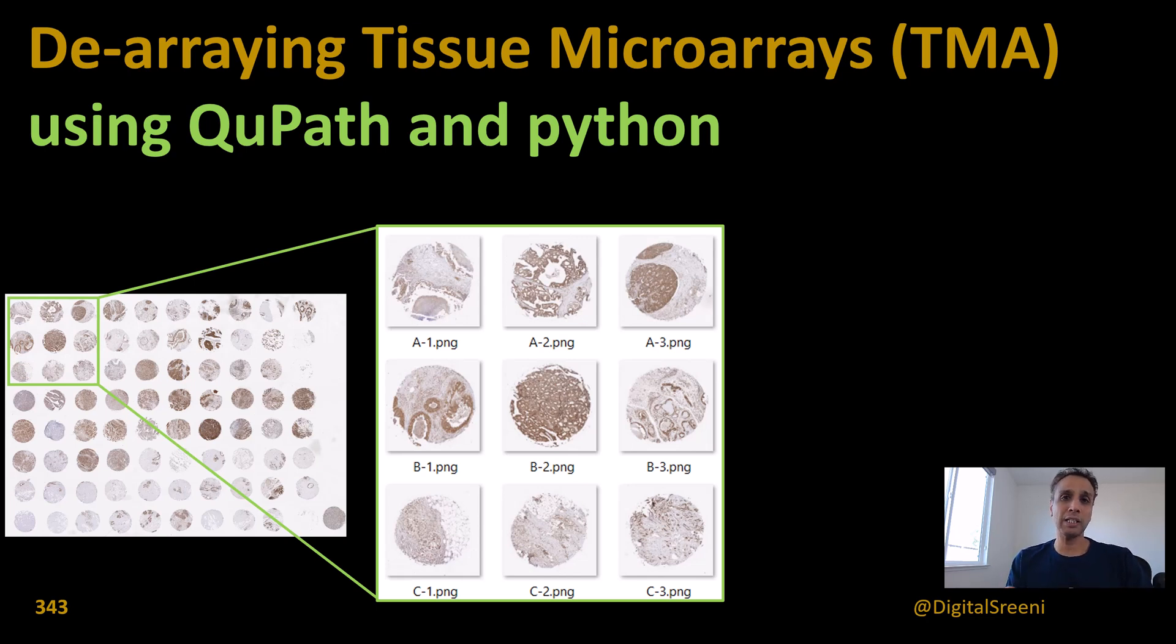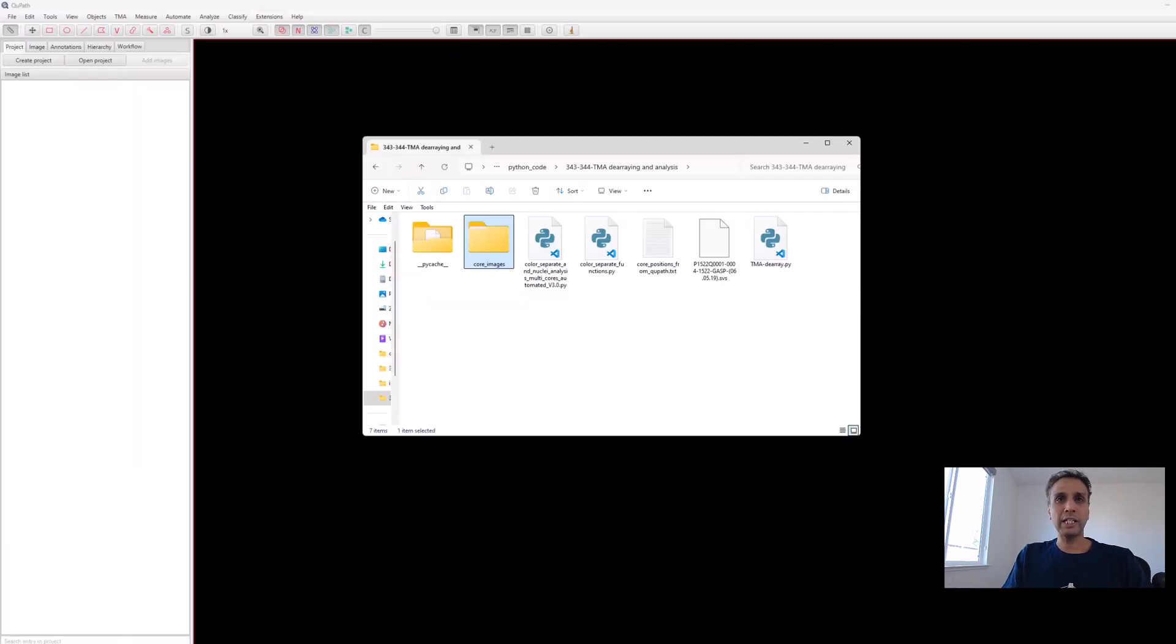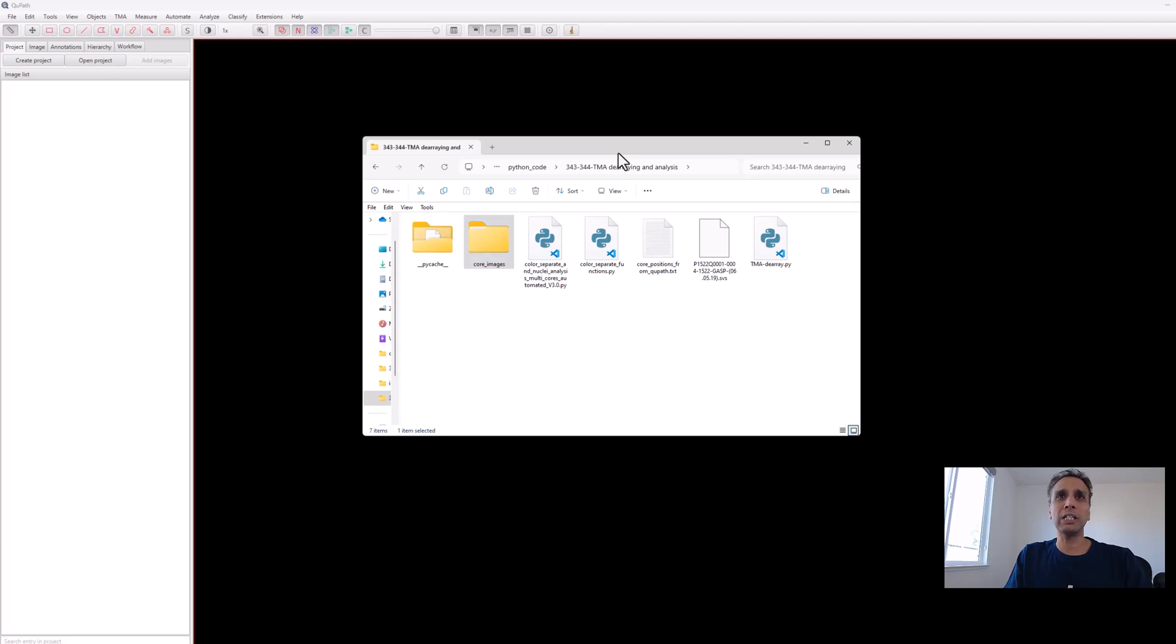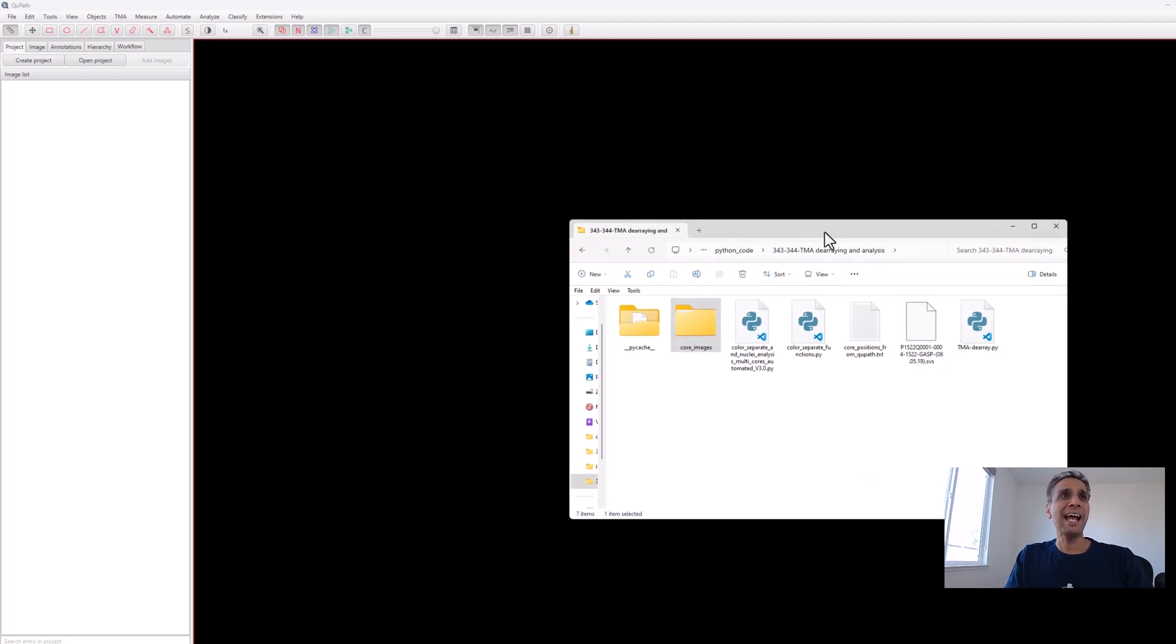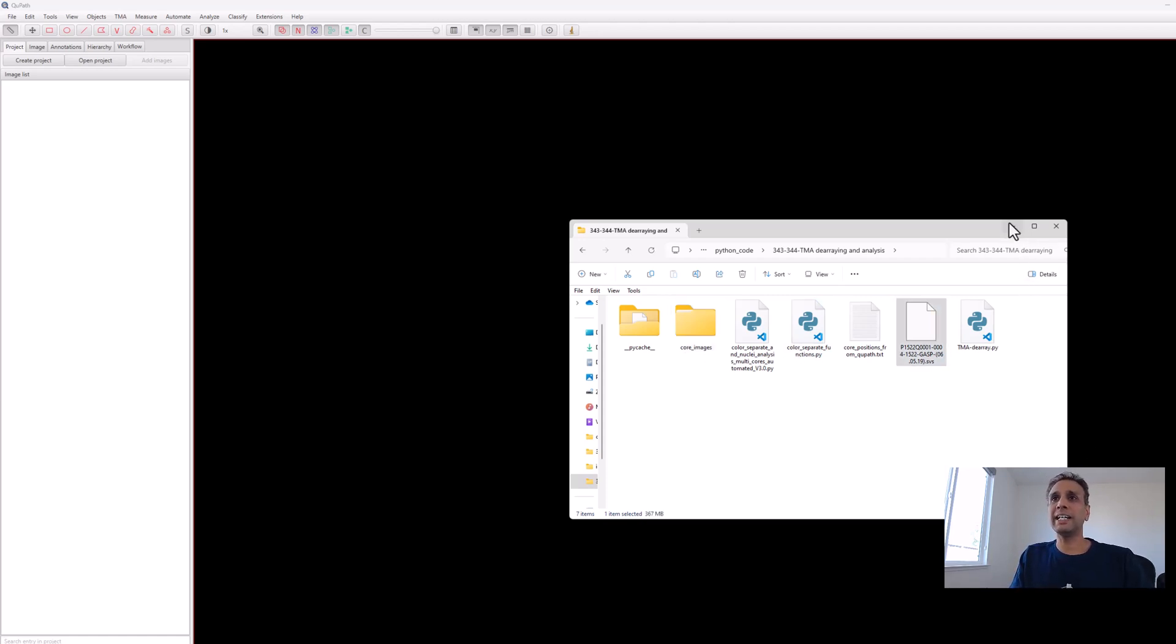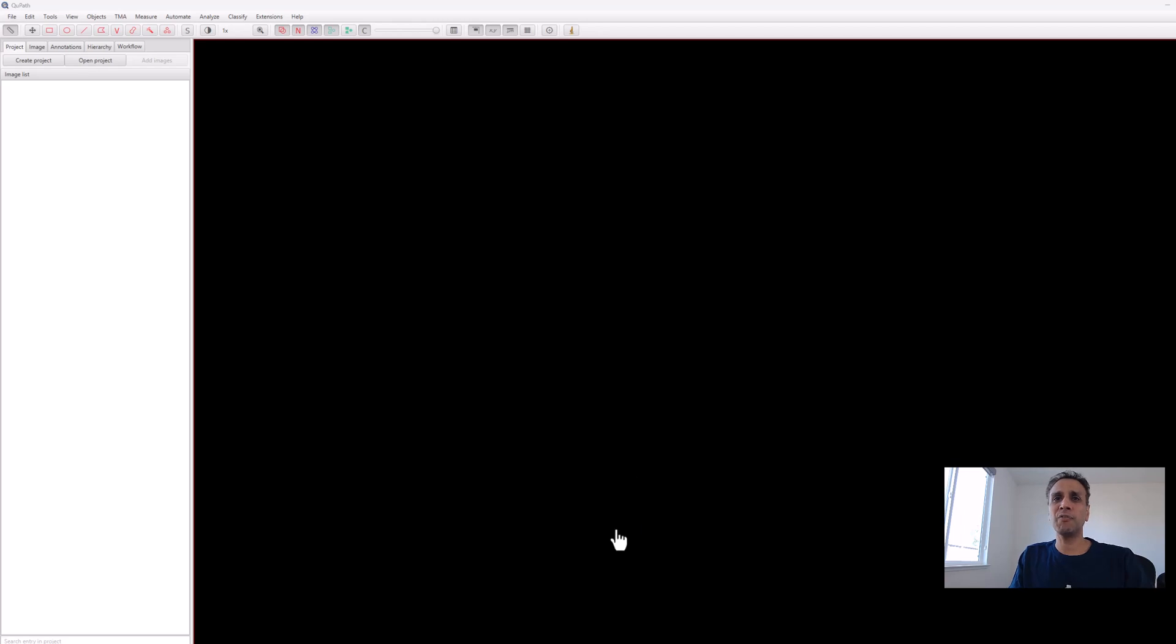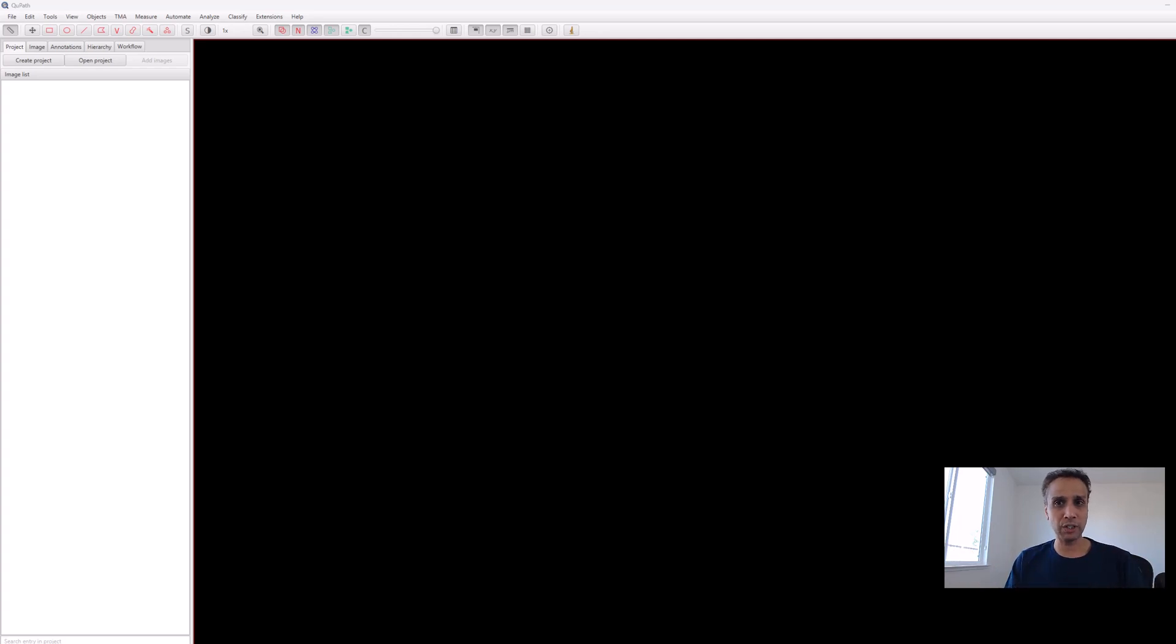Let's open one of the whole slide image files in QuPath. This is version 0.4.0. I've had this on my system for the last couple of years; they probably have a newer version, but I don't see how things would change dramatically. Let me drop the SVS file.